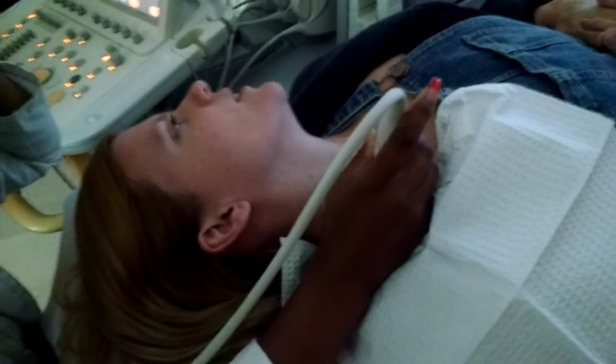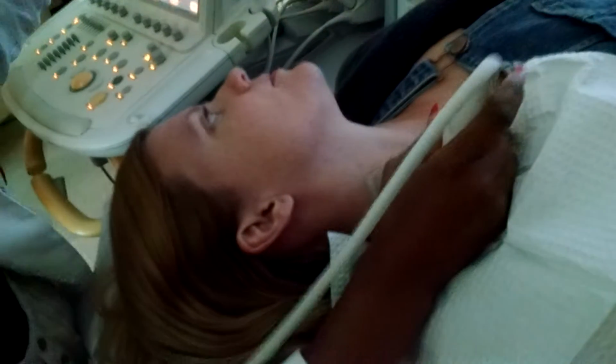but I'll try. Okay, so I start at the clavicle. If I angle down my beam towards the clavicle, that's the subclavian right there, I can tell. Probably the vein down here. Okay, so you're angling posterior to get that view? I'm sending the beam under the clavicle.